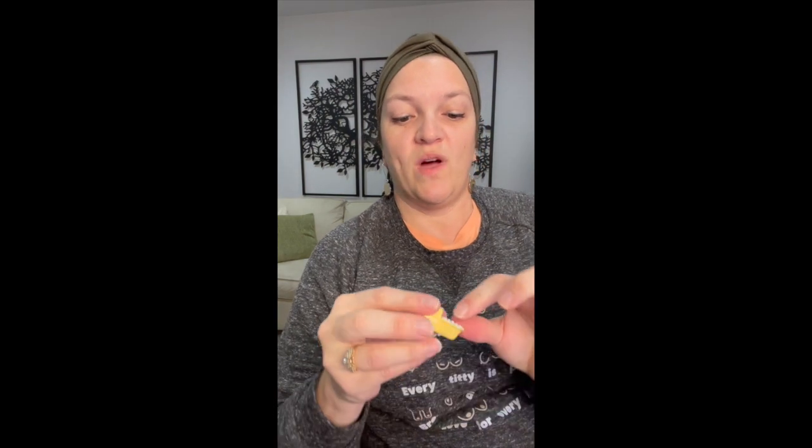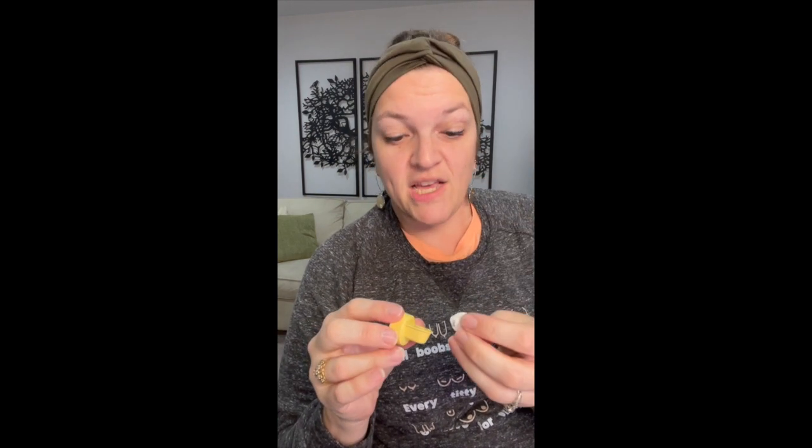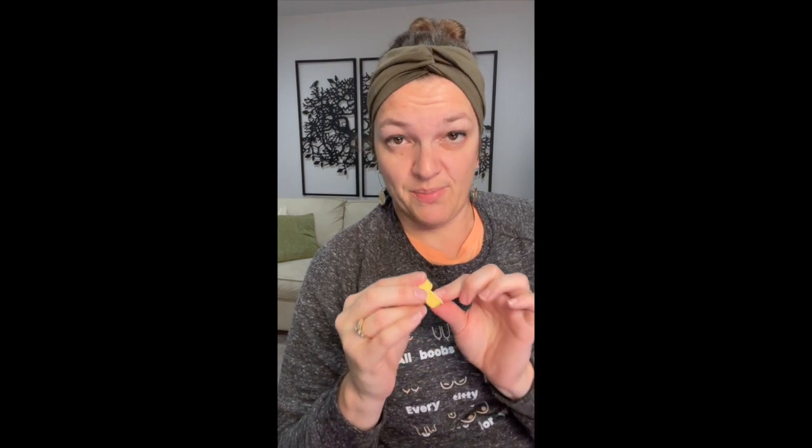Now, these are not my favorite. These white pieces should be taken off every single time to clean them. These do wear out with time, so you want to be replacing these routinely. If you bought the pump or it came from your insurance, inside the instruction booklet is a second set of these. So if you need to replace them, Medela has already given you the first set to replace them. They do warp and wear out with time and use, so if you're not getting as much suction as normal, you'll want to make sure that you replace these.